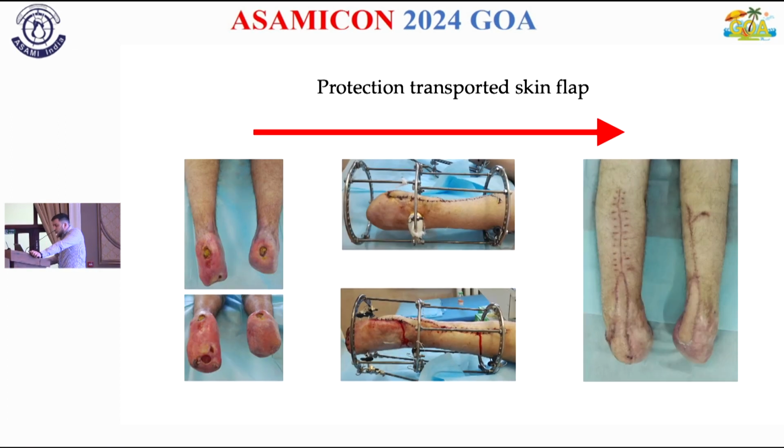And a simple possibility is protection of a transported skin flap by Elizarov. It's a very useful technique because it can offload the transported skin graft and can give us more comfortable change of dressing postoperatively.